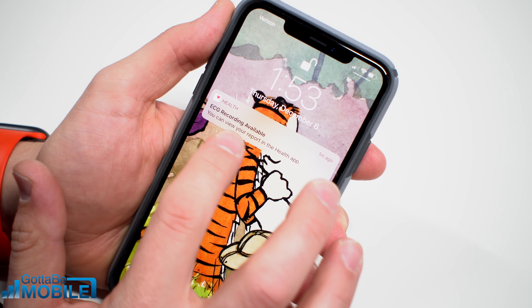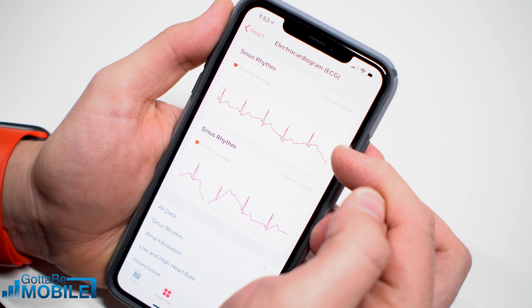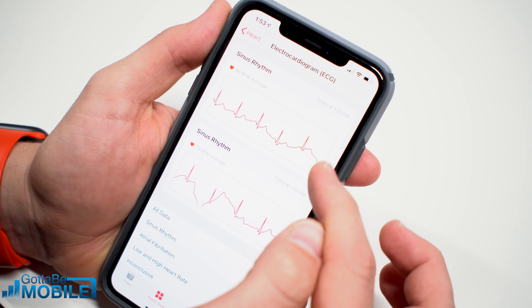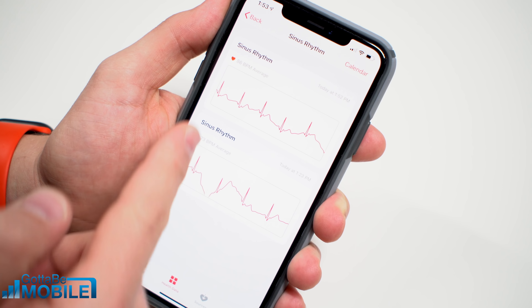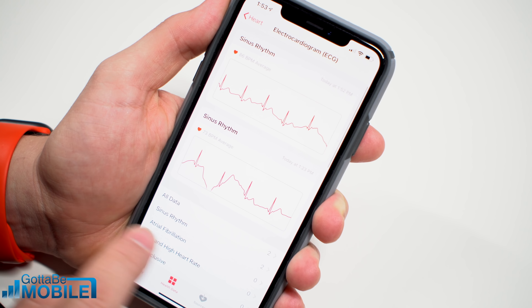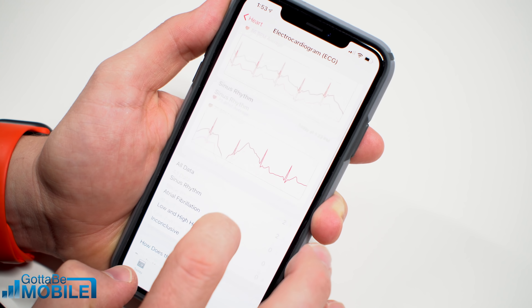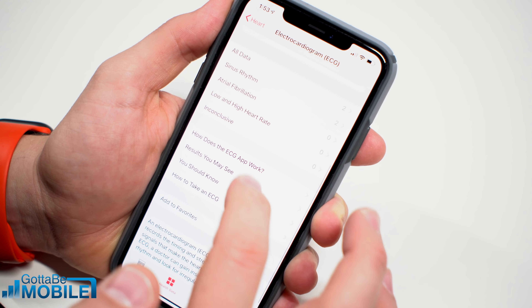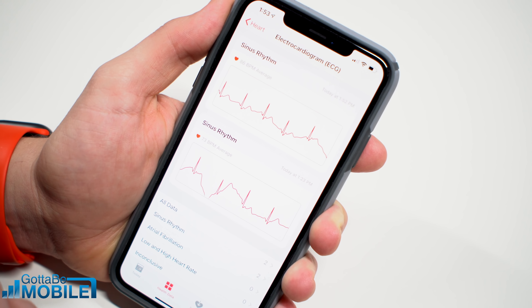Here you can see I have an ECG recording available in my health app. If I tap on that, it's going to show me my ECGs that I've taken so far — I've taken two of them. I can see my sinus rhythm and I can see I have no reports of atrial fibrillation, low and high heart rate, or inconclusive. You can see all of that and take all that information together, and then you're going to be able to share that with your doctor.